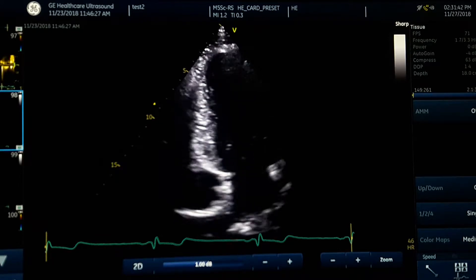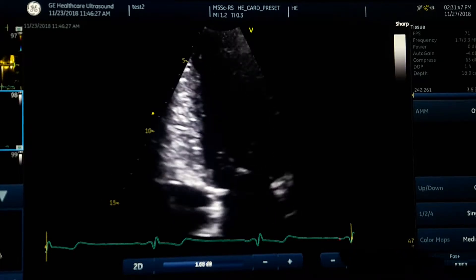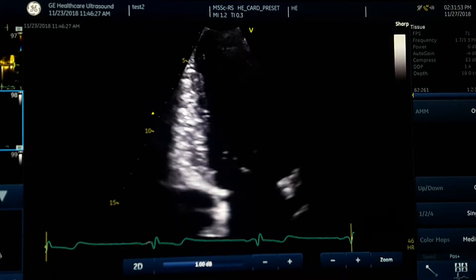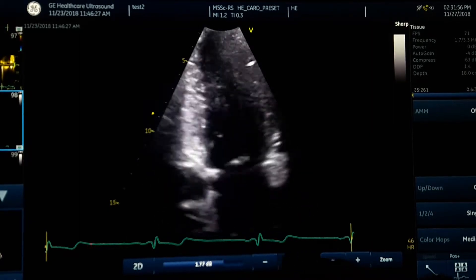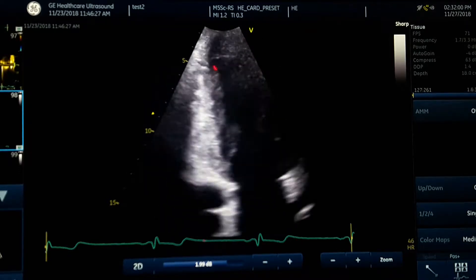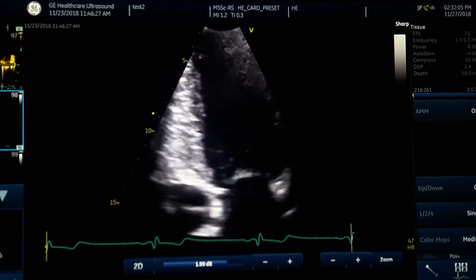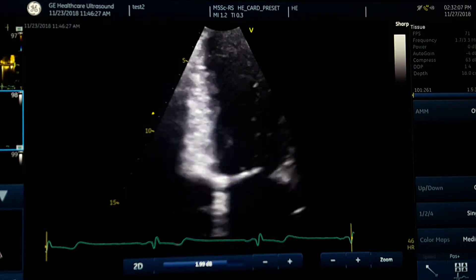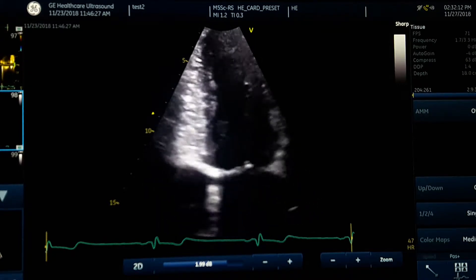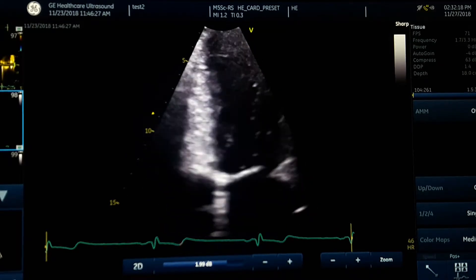When you are evaluating wall motion, don't forget to always increase the gain and show the endocardium clearly. Here my gain is low. I increase the gain and you will see the myocardium and endocardium of the anterior and inferior walls show up very clearly. Zoom in and optimize your image using gain and other modes to show clear endocardium and myocardium in both walls.